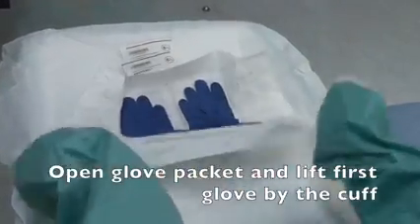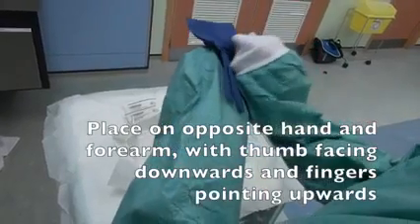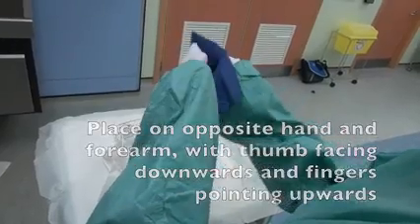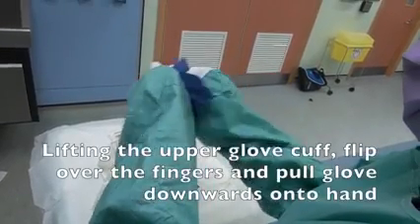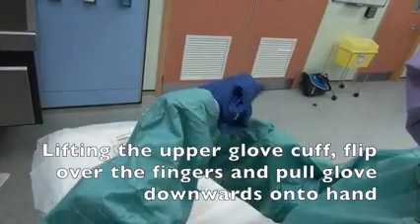Open the glove packet and lift the first glove by the cuff. Place on the opposite hand and forearm with thumb facing downwards and fingers pointing upwards. Lifting the upper glove cuff, flip over the fingers and pull the glove downwards onto the hand.